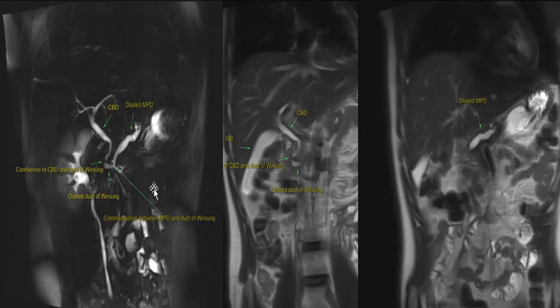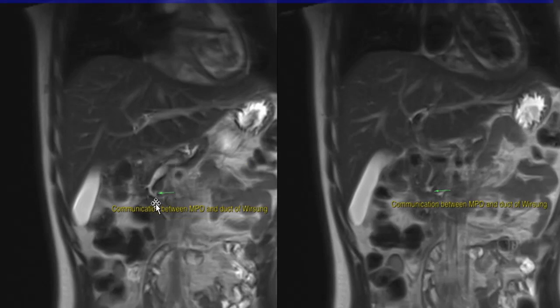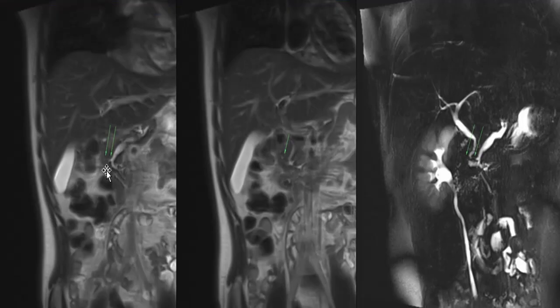Coronal thick slab MRCP and T2 non-fat sat images show variant pancreatic ductal anatomy with a dilated duct of Wirsung. The dilated duct of Wirsung is seen to join the CBD and drain the ventral pancreas at the major papilla. The main pancreatic duct is dilated with dilation of the side branches, and communication is seen between the dilated main pancreatic duct and the dilated duct of Wirsung. A small outpouching is seen along the lateral aspect of the main pancreatic duct with a thin channel, possibly representing the duct of Santorini draining into the minor papilla.